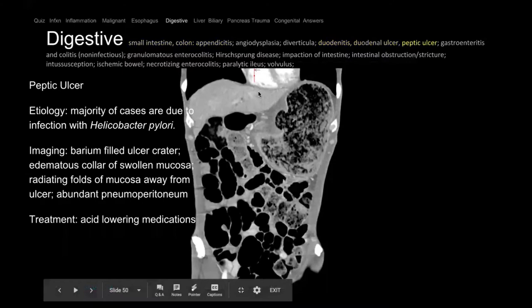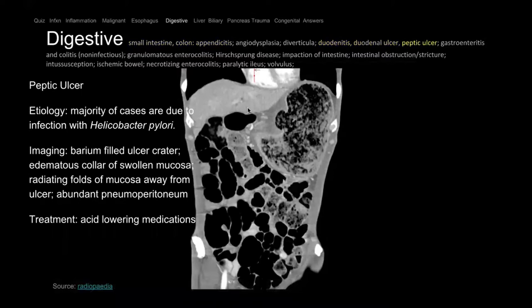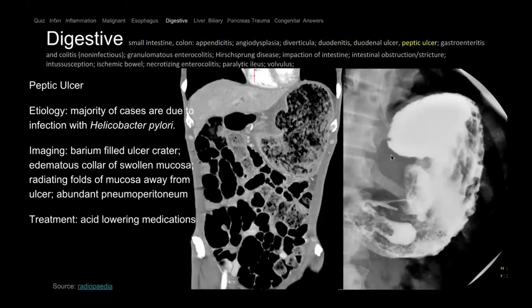Peptic ulcers. Here's a CT coronal image showing stomach, liver, large bowel, heart, greater and lesser curvature of the stomach, and there's an abnormal outpouching — that's an ulcer — a cavitation within the wall. The corresponding upper GI shows the outpouching as well. This is a giant ulcer, most commonly from H. pylori. With antibiotics and proton pump inhibitors, we don't see it as much anymore.